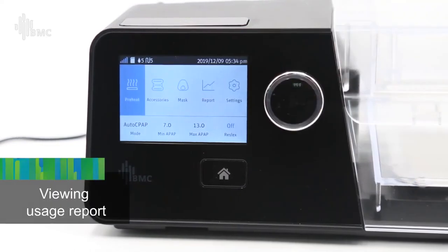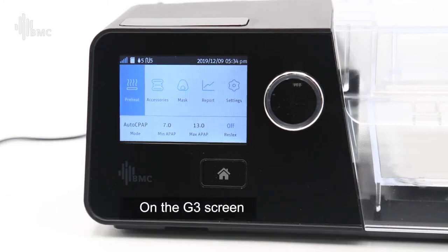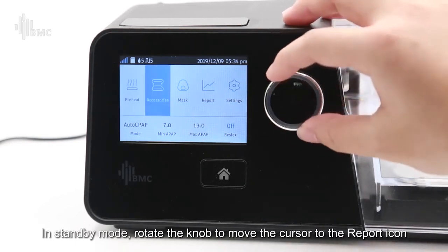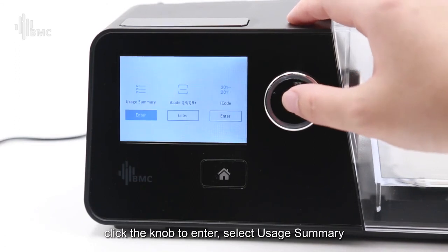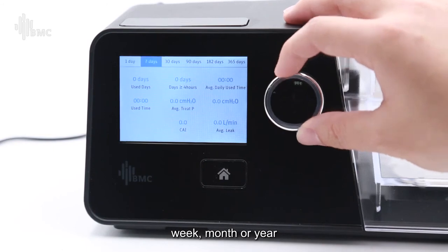Viewing usage report. The BMC G3 supports a variety of ways to view the usage reports. On the G3 screen, in standby mode, rotate the knob to move the cursor to the report icon. Click the knob to enter. Select Usage Summary, and you can view the usage report for the last day, week, month, or year.